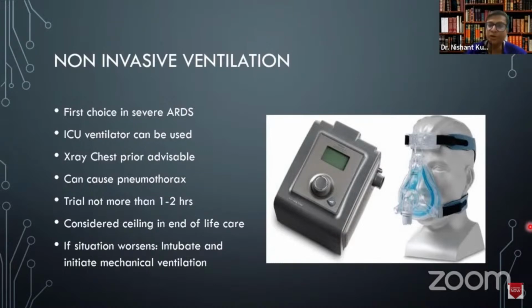Now, this is very important. Why? Because if you use the mask with the exhalation valve in the two-limb circuit with the ventilator, the pressures will never be achieved because there will be a constant leak from the exhalation valve. Similarly, if you use a non-perforated mask, or the mask with no holes, with this machine, imagine the patient cannot exhale to the atmosphere at all.